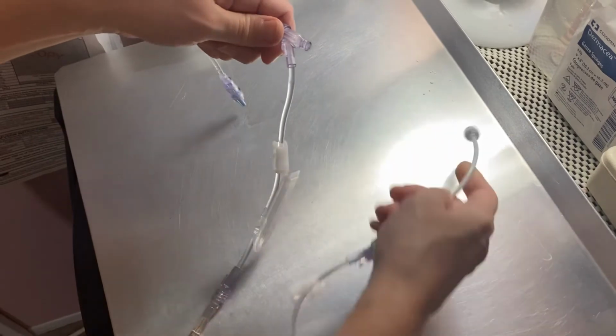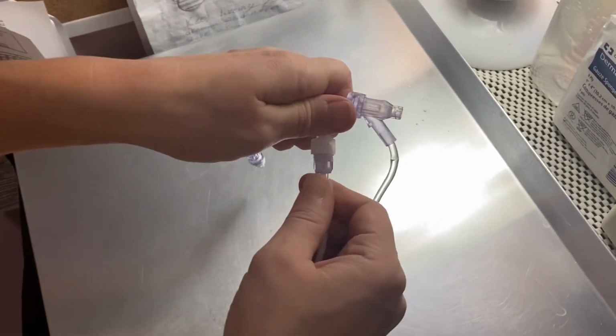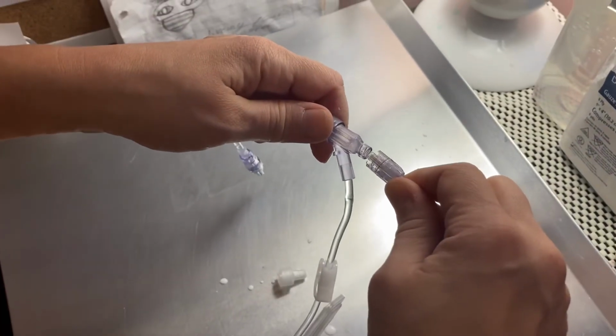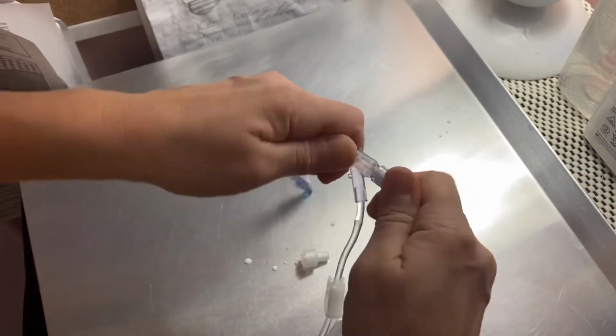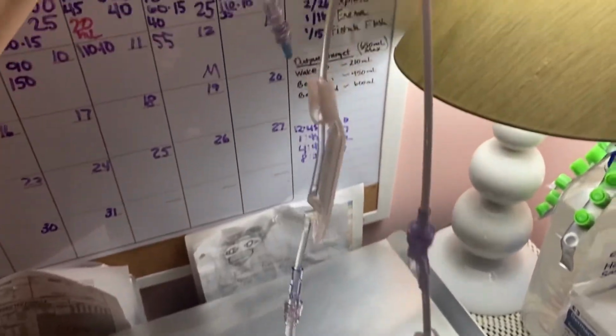While it dries, pick up the lipids line and carefully remove the cap from the end of the tube. This is already sterile, so you don't need to scrub it. After 15 seconds, push the lipids into the connector piece and twist until it is snug. You have just wired in the lipids.